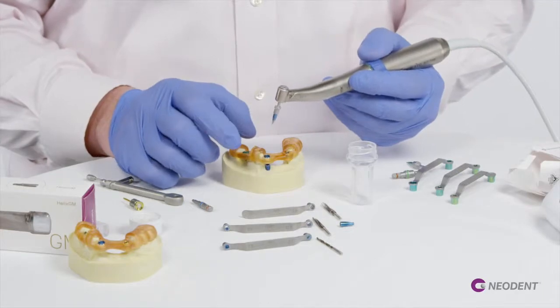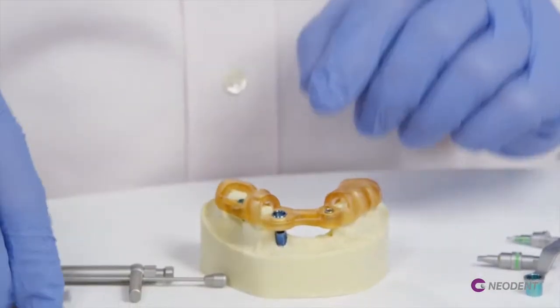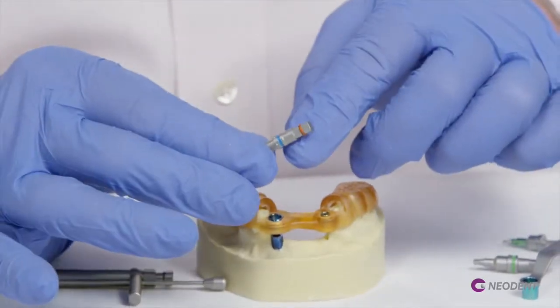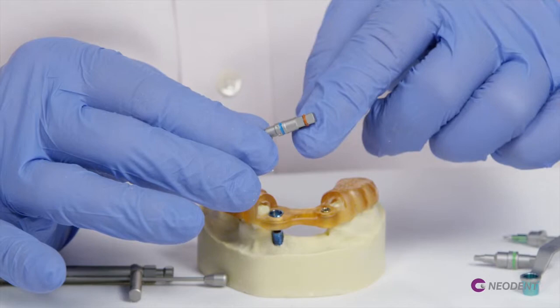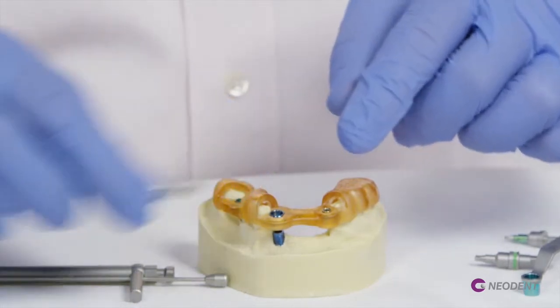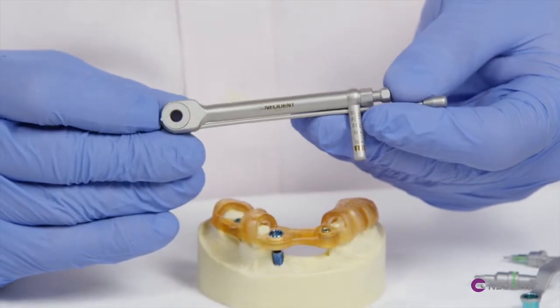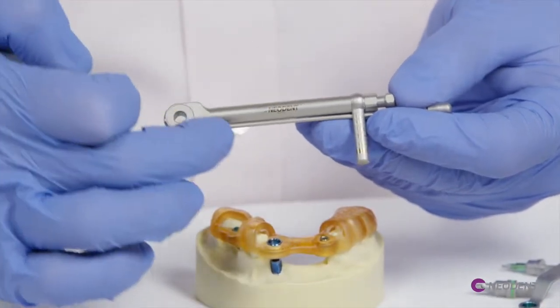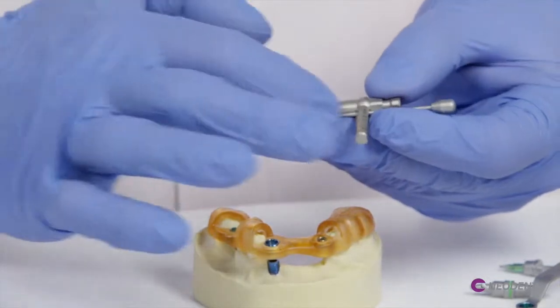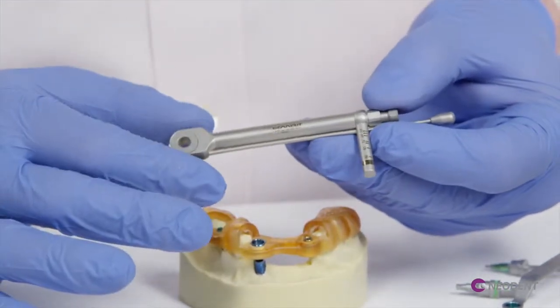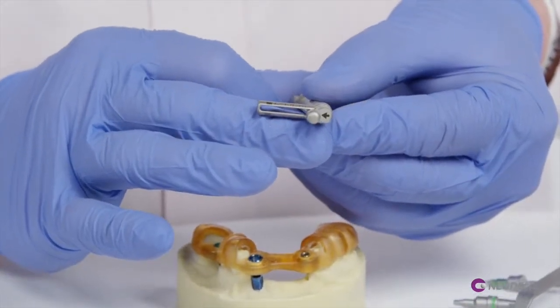I remove my implant driver from the implant itself and disengage. We're going to finish our implant manually with the implant driver that has a square hole on the top that fits our torque wrench. Just prior to doing that, I want to make sure our Neodent torque wrench is set up properly. I want to be able to read Neodent on top of our wrench. I want that bar facing towards me and I want to make sure that the arrow on the end of the wrench is towards to tighten.